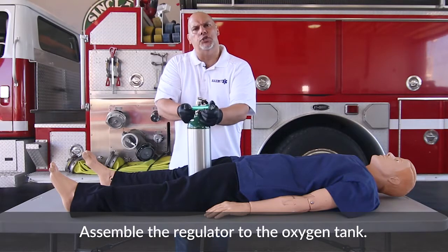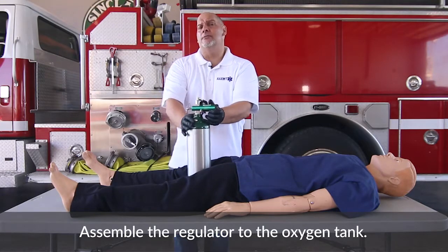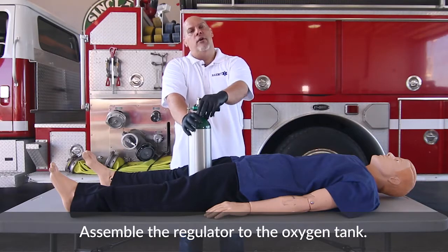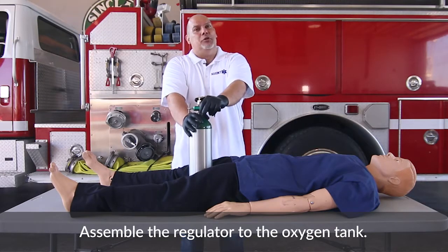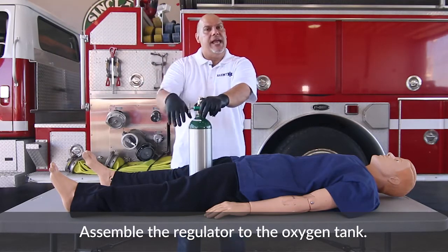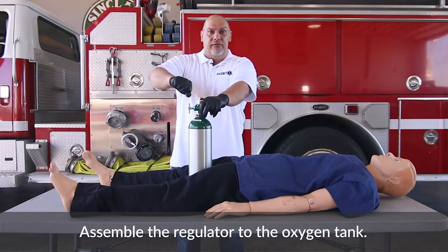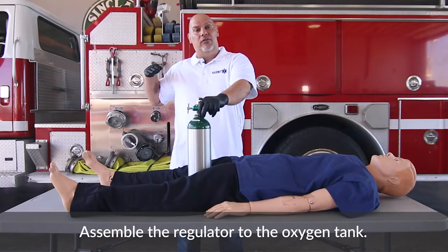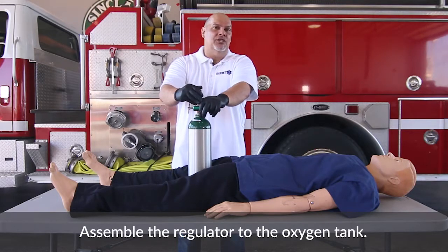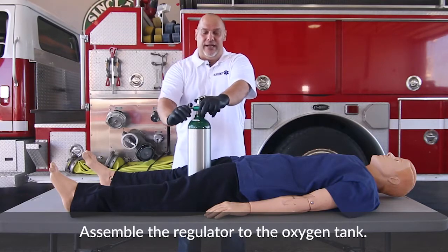One thing to caution you on: these bottles usually come filled with about 2,000 PSI. If you drop the bottle and the valve breaks off, it becomes a serious projectile. I once dropped a large oxygen cylinder into an ambulance, the valve hit and broke off, and the bottle — which had 2,500 PSI — went skidding across the road and wedged into the wheel well of another ambulance. We must make sure those don't become projectiles.